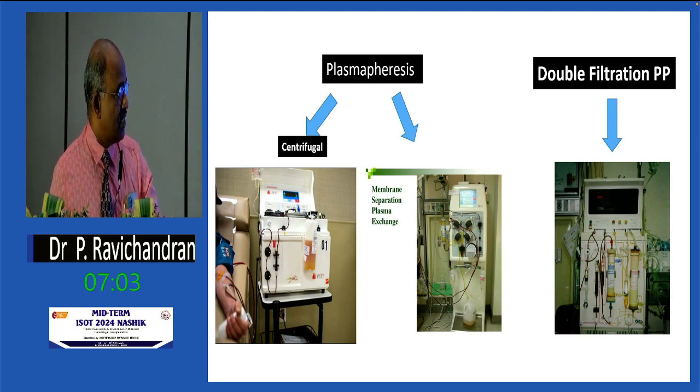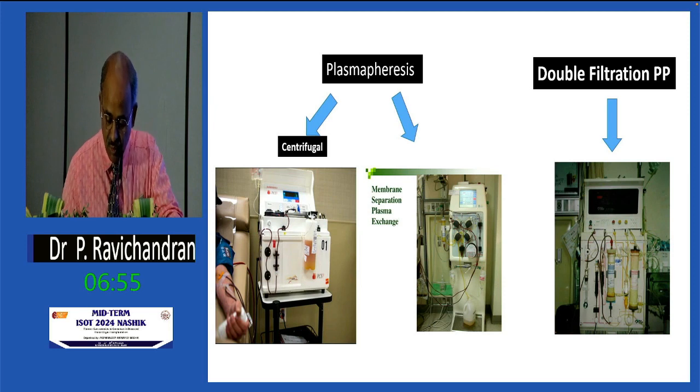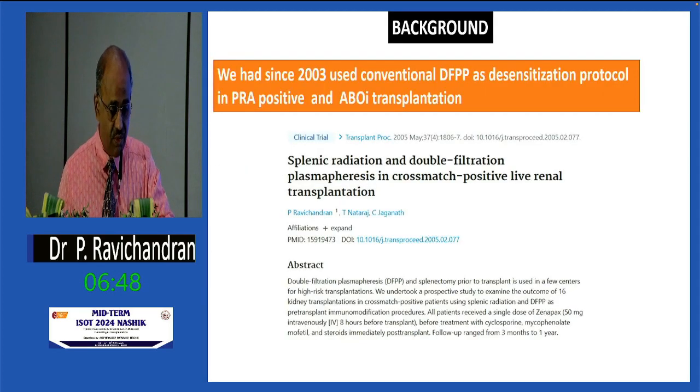So this is plasmapheresis. Either we use the centrifugal method or membrane separation, and DFPP involves a second filter. Depending on what component we want to remove, we have various filters available. And adsorption is another procedure, like ABO, which we commonly use.